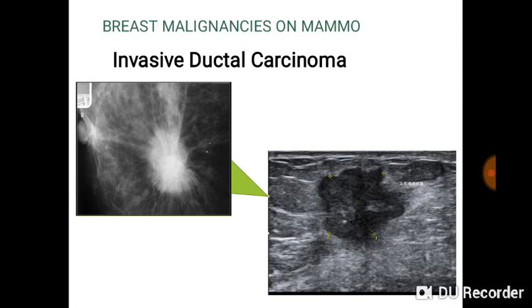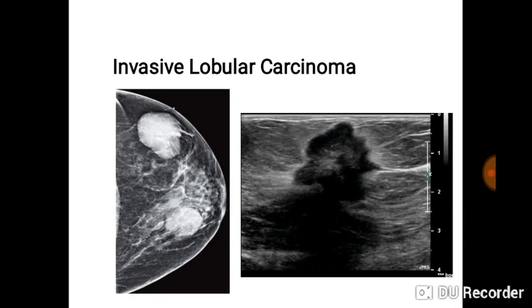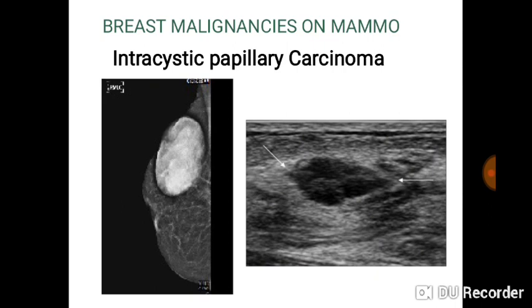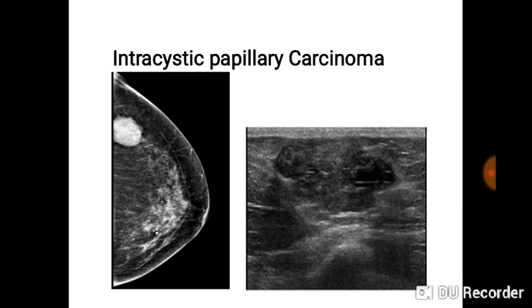We can see some examples of breast malignancies on mammograms. Recall invasive ductal carcinoma, which we saw on ultrasound — here we put them side by side so you can see how it appears on a mammogram and how it appears on a sonogram. That's the essence of correlation. You can also see invasive lobular carcinoma, comparing its appearance on the mammogram to the sonogram lecture image. This is the intracystic papillary carcinoma, and you can see the way it appears on a mammogram.